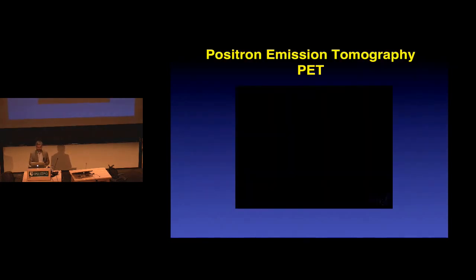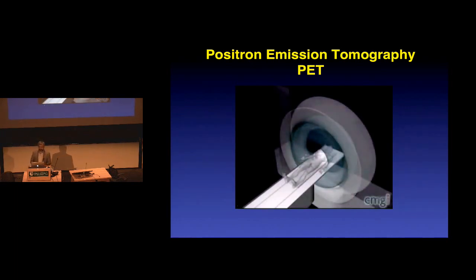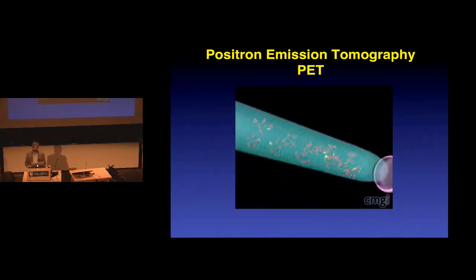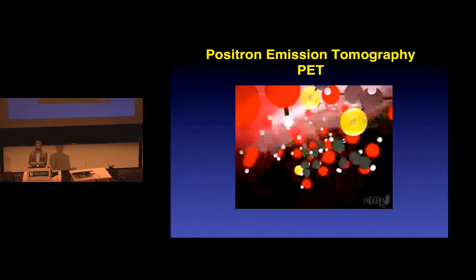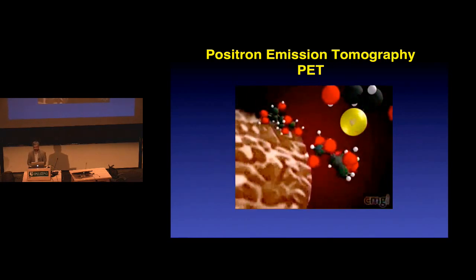So I have this very cute little video that Simon Cherry shared with me some time ago. So you can imagine, here's your chance to have a PET scan virtually. There you are in the scanner. We're going to zoom in. We have a nice syringe full of radioactive molecules, which of course always sparkle. And then when we push the syringe and inject, we're going to fly through your veins, go around your body, and the molecules will move around, and eventually, by random chance, will arrive at any particular tissue.